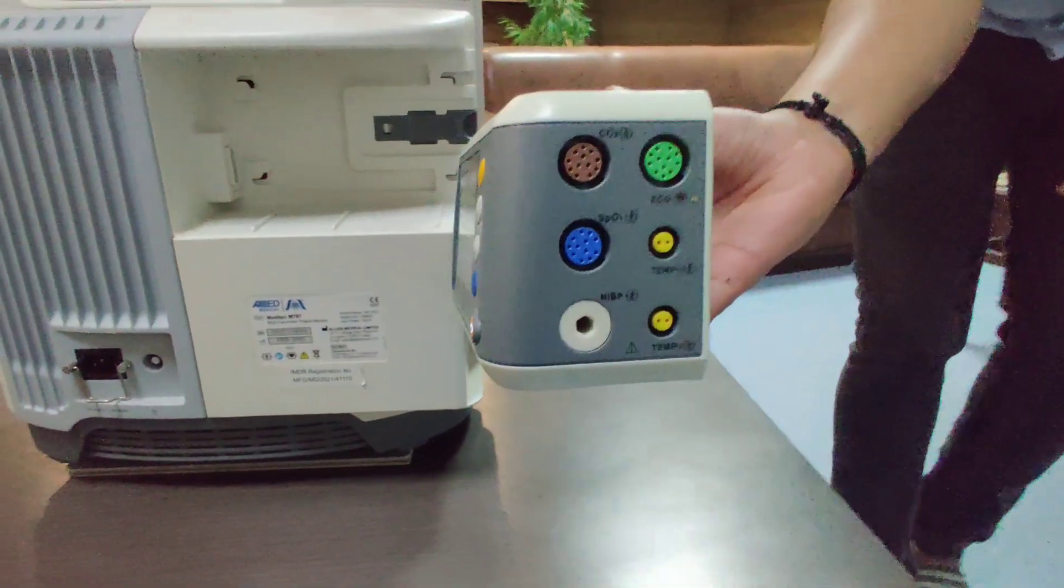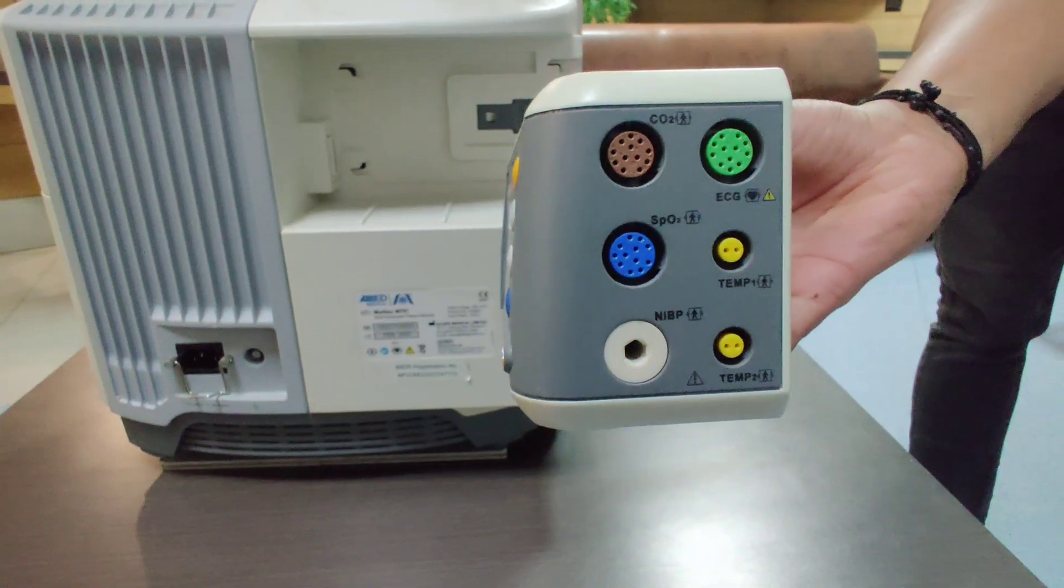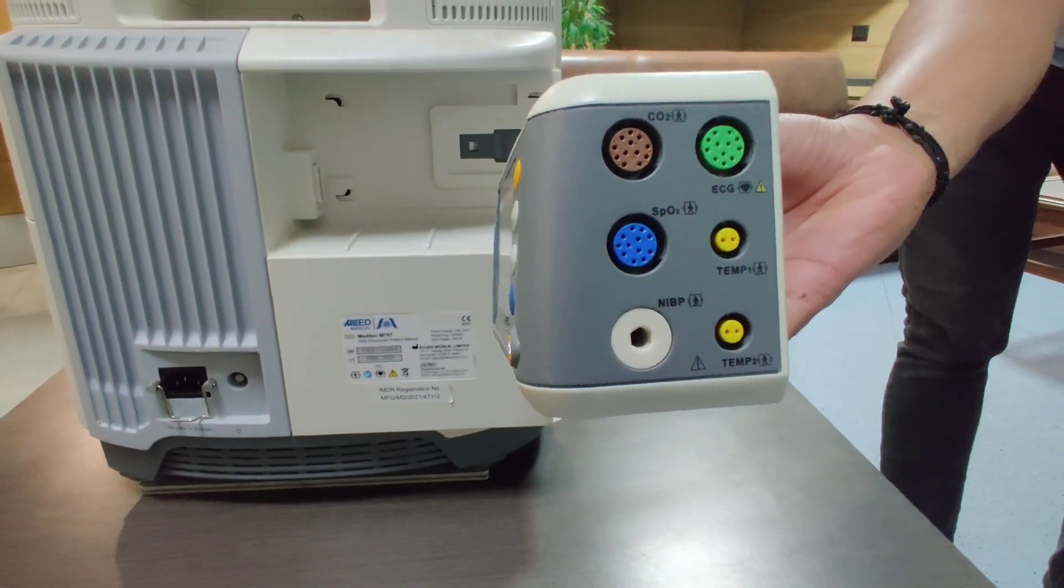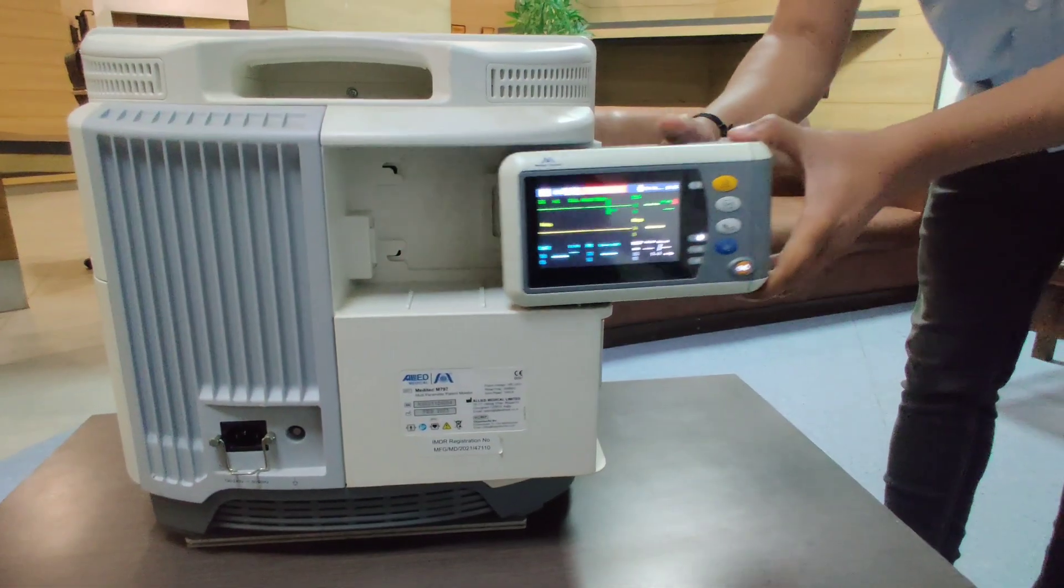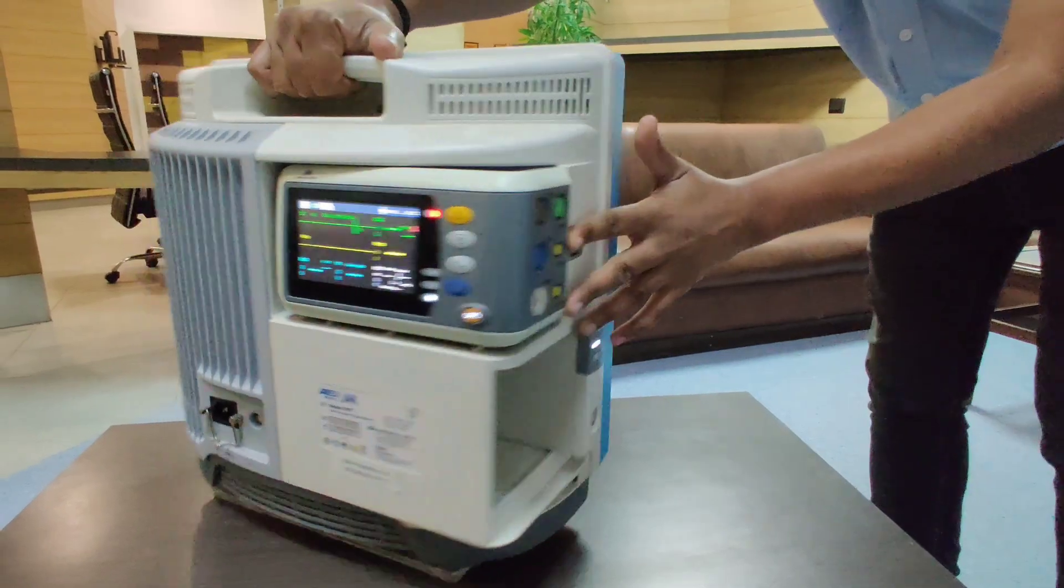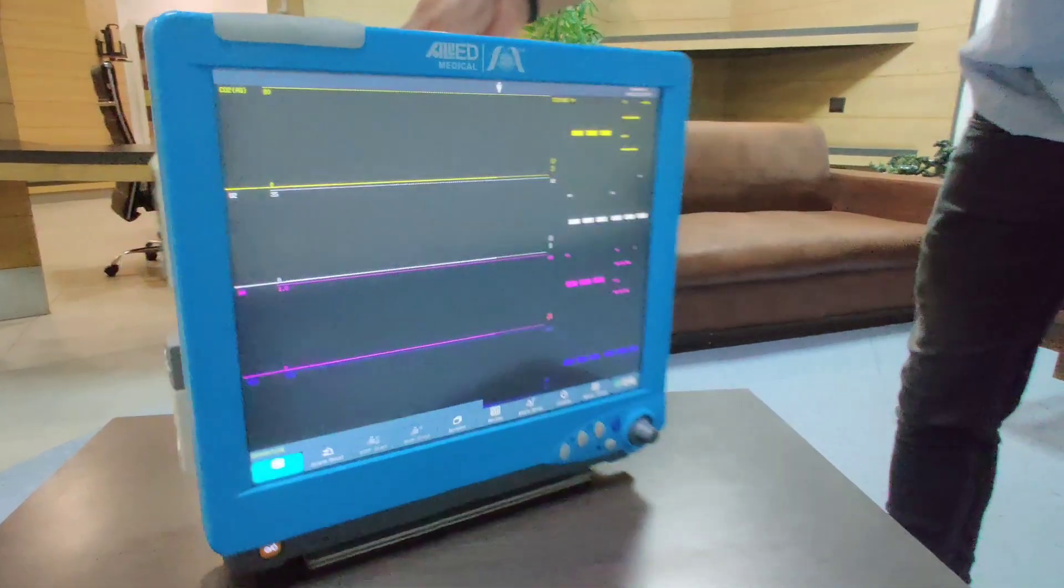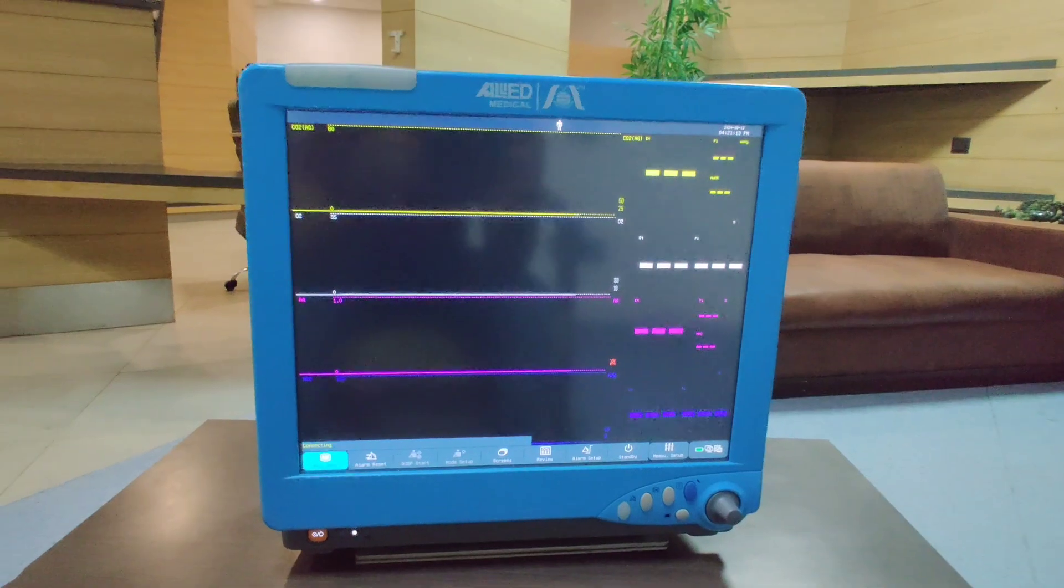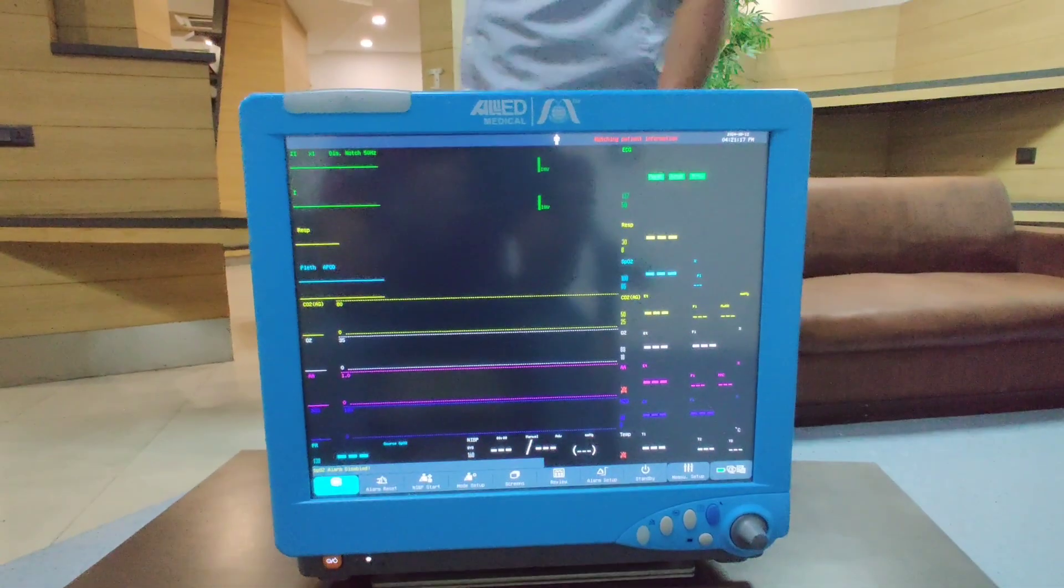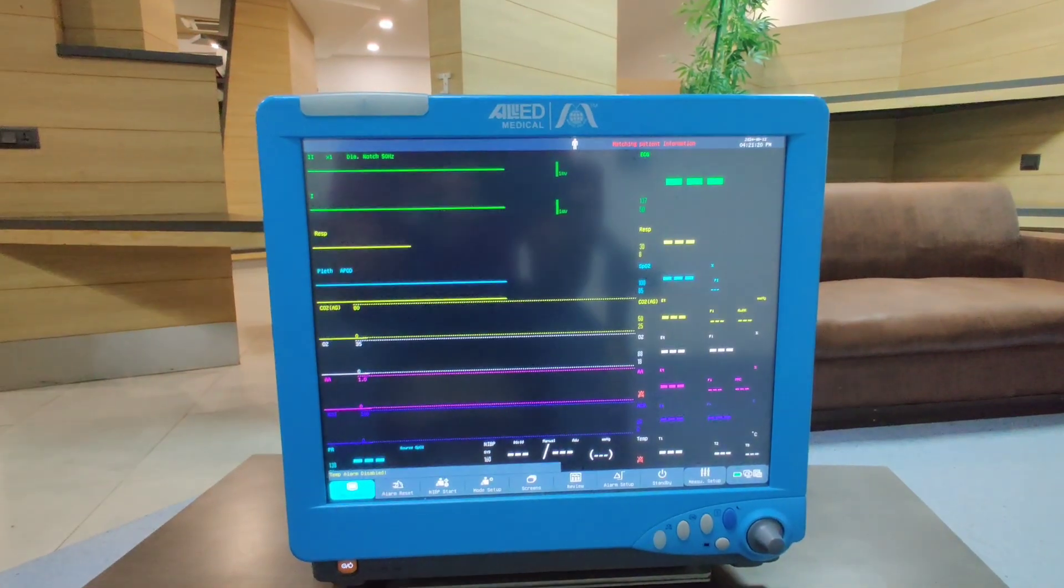These are all the connectors on the side where you can connect all the parameter probes. As soon as you connect it back to the patient monitor, all the data will get transferred to the monitor. The transport module itself has a battery backup of eight hours, and the 797 as a whole has a battery backup of two hours.